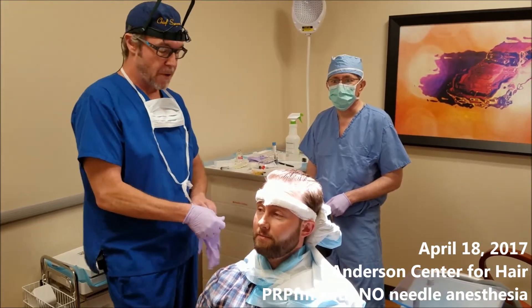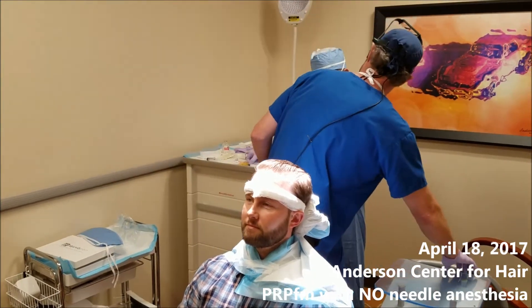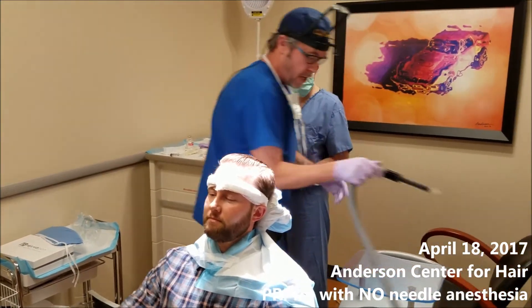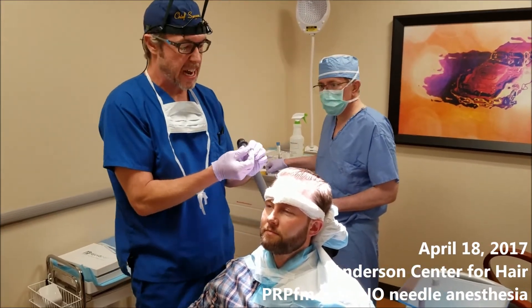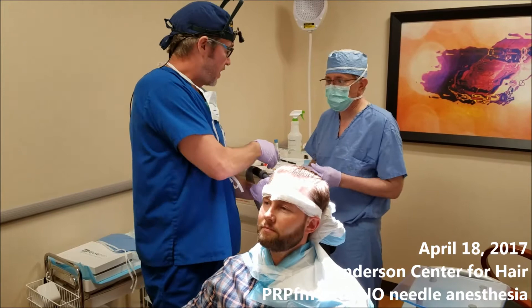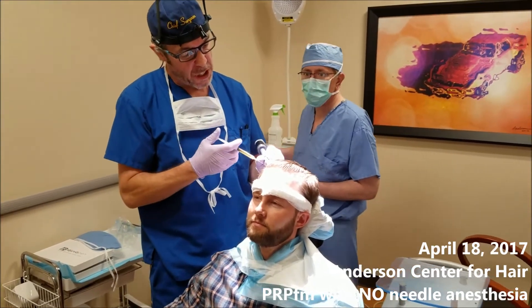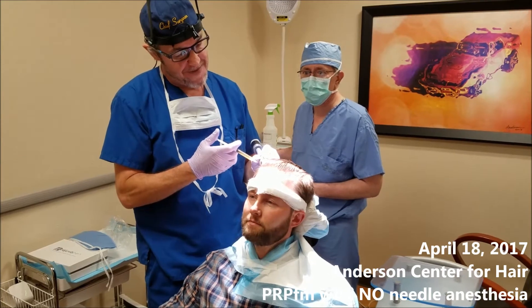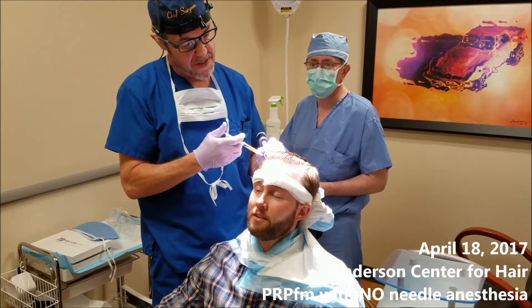How are you doing today, Todd? Doing well. So what we're going to do is go ahead — we've got our PRP drawn up. Here is the cooling tip. We've got little sterile handles on here, so Todd's all set. I'm going to start right here and we're going to cool this. Does that feel good and cool? Yeah. How much does that hurt? It doesn't hurt at all. Can't even feel it.